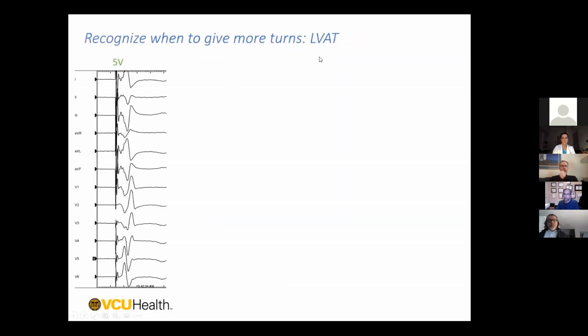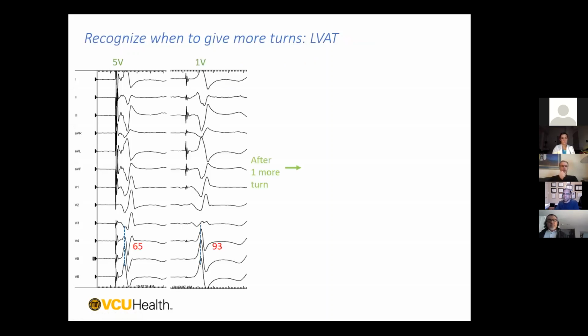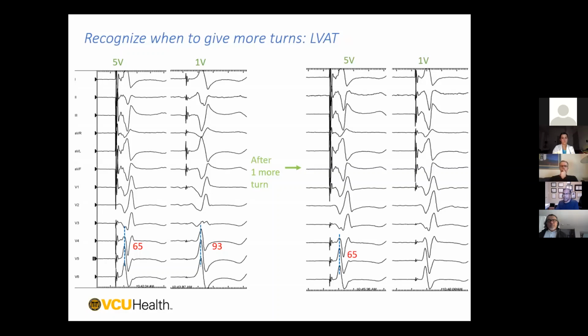So how do you know when you should be giving more turns? In other words, how do you know that you're done? Okay. And I really like this because here Santosh is comparing the left ventricular activation time, or the LVAT, which is the distance from the pacing spike to the peak of V5. I usually use V5 to measure this. And you can compare it when you're doing high output pacing, where you're more likely to be capturing the left bundle, to low output pacing, where you really have to selectively be in the left bundle to capture it, right?